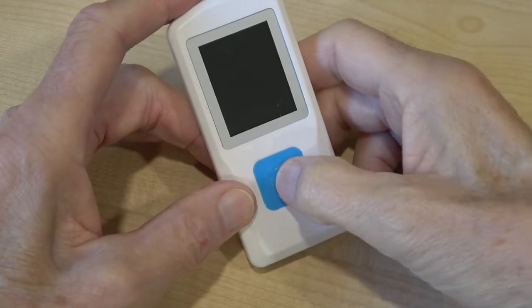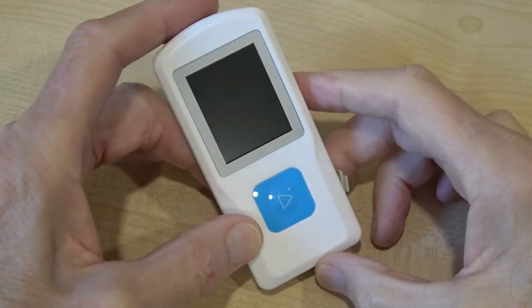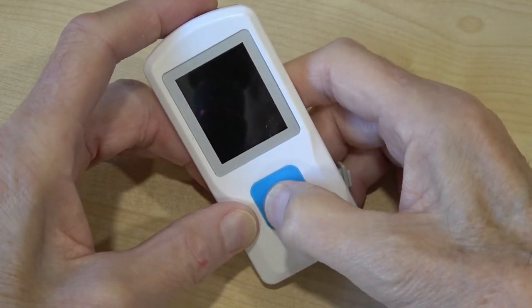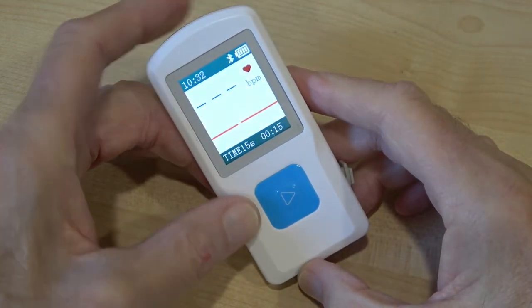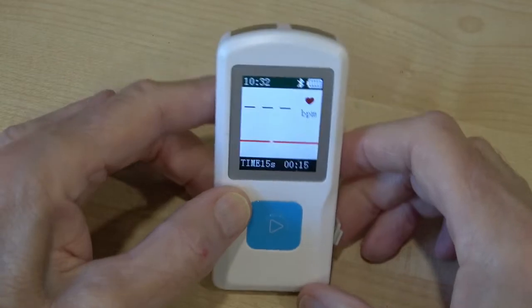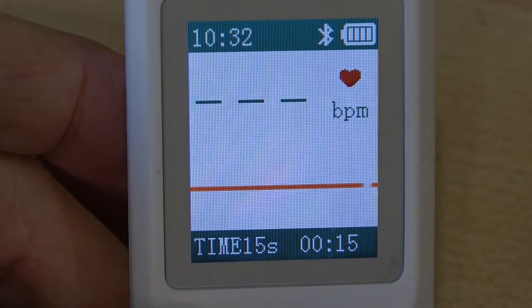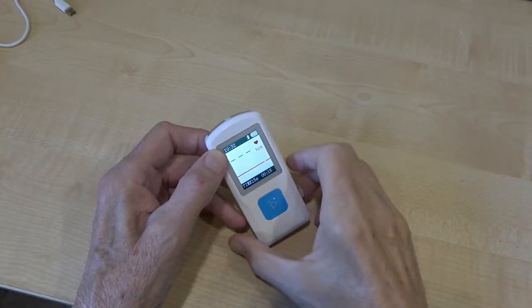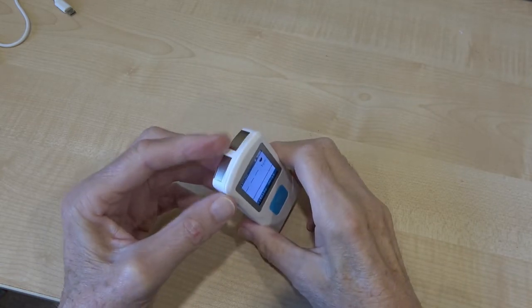Let me show you how to use this machine. You press and hold the little button here for about five seconds, and you're greeted with this screen — it's basically waiting for you to do something. Now there are several places you can attach these sensors to.